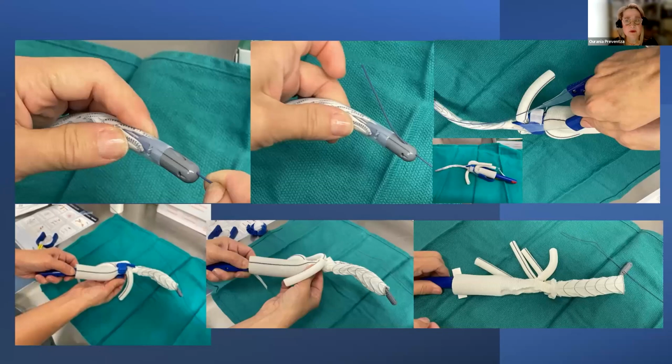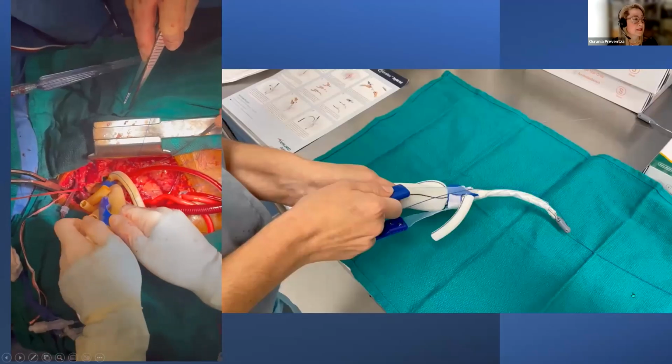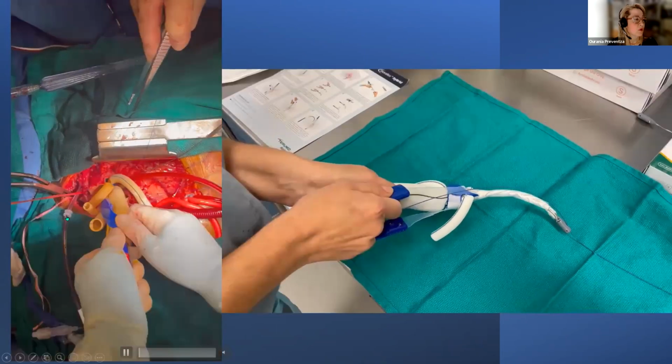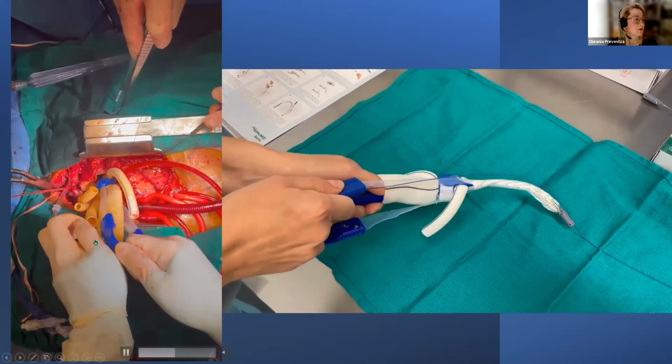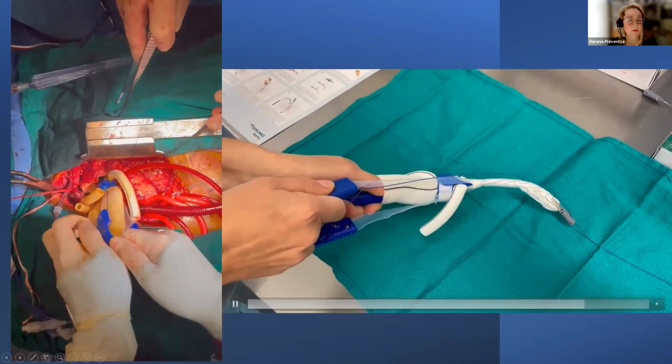This is a demonstration that we saw very well. Arminder saw before: placement of the wire, and then you pull the strap back, and the device is still constrained, and then you have to pull the red knob to have the device completely unconstrained and deployed. So here in the operating room, I place the device through the hole of this malleable shaft, and you can see here deploying the device. Here I should have held this a little more steady, but I put my palm on it. You can see it is definitely better to just hold it with your hand there and deploy the device.